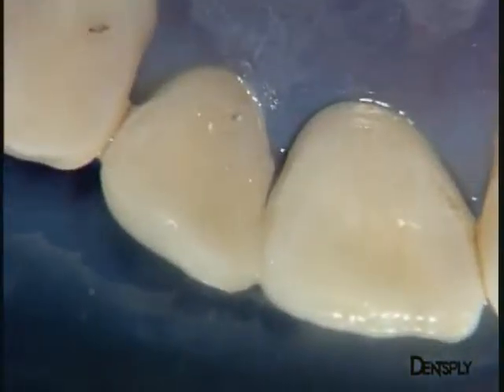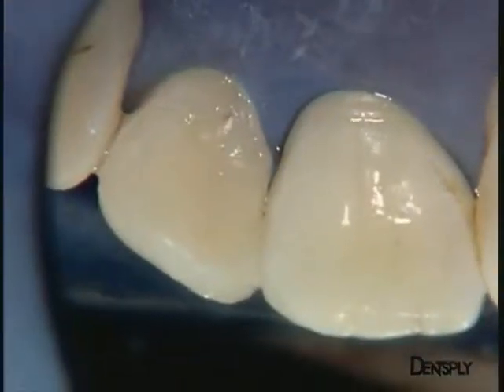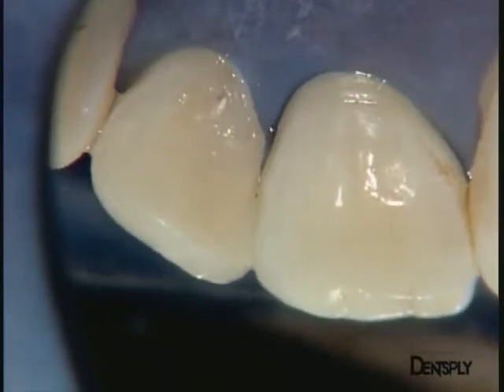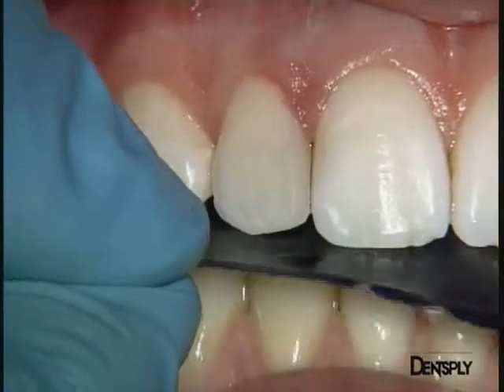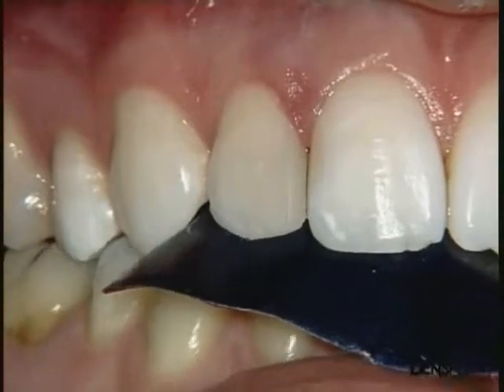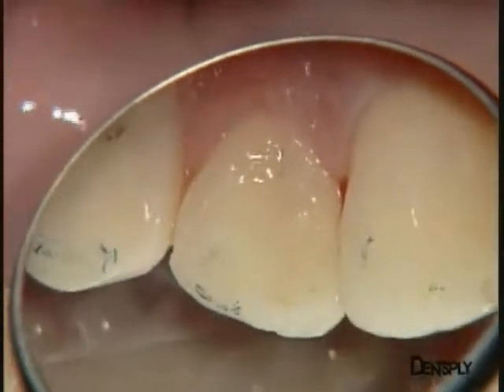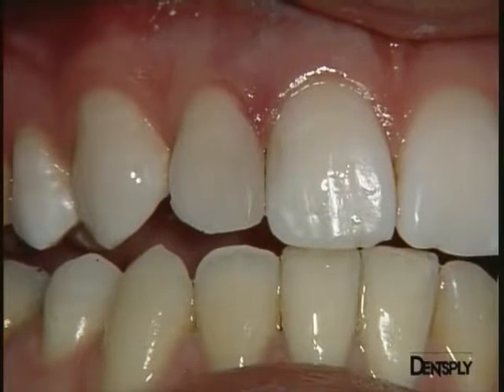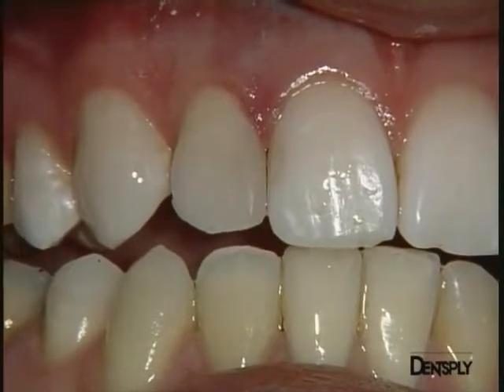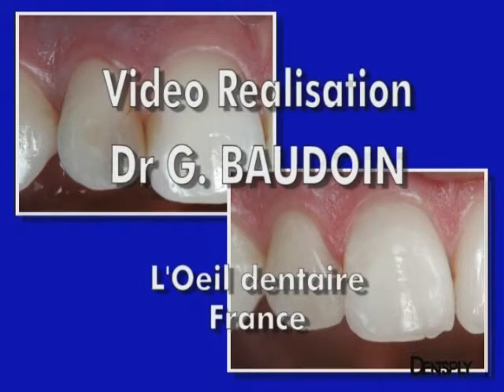In the lingual view, we can see that the stratification imitates the dental anatomy well and reproduces the colour effects of the natural tooth. Once the operative area is cleared, it remains to check the filling and remove any excess. Thanks to the key and the build-up of the lingual wall, there is only very little excess composite. Here is the result just after the removal of the rubber dam. With a simple stratification of Ceramix Duo, a satisfactory aesthetic result is obtained.